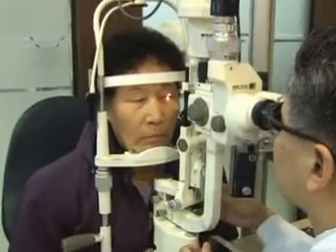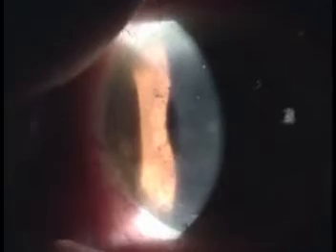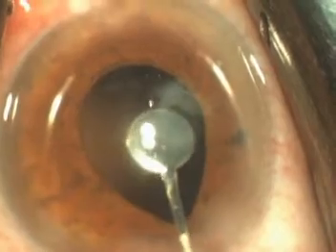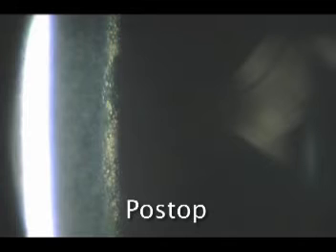To determine what this lesion was, the surgeon examined the patient's cornea immediately post-operatively. Slit lamp examination showed the same lesion that was present during surgery. Specular microscopy showed endothelial cell loss in the area of the lesion.